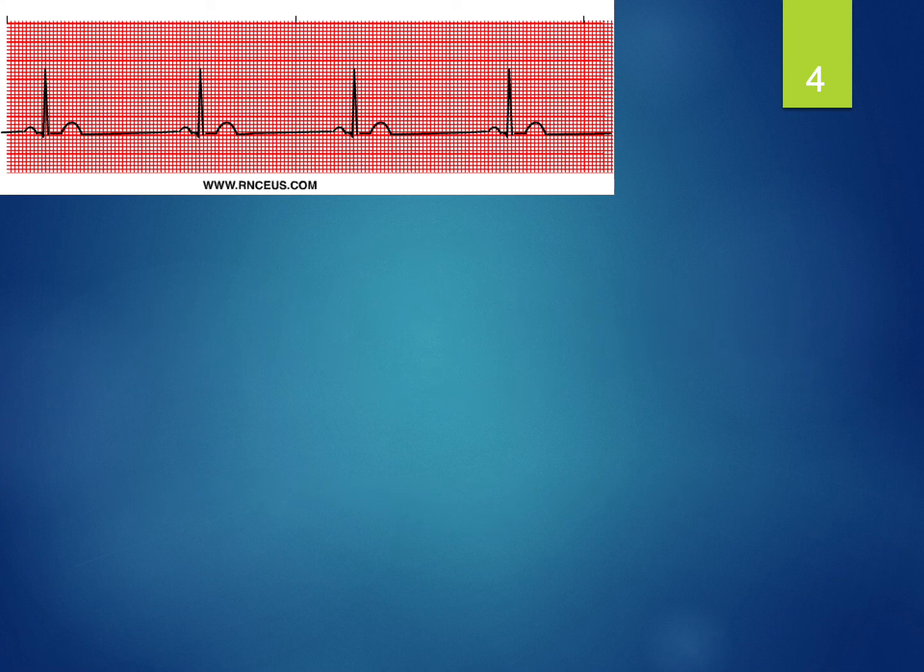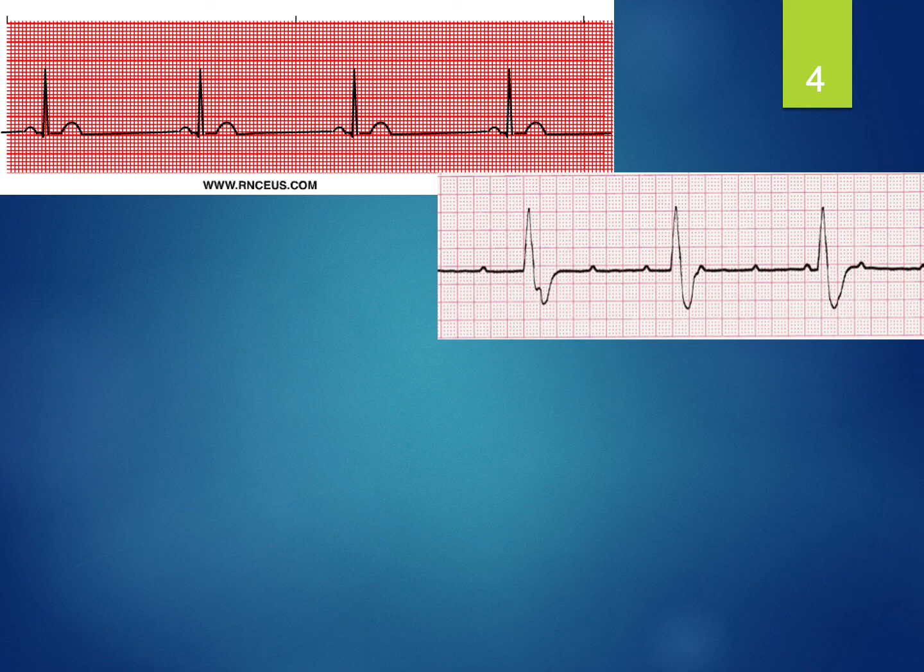So, symptomatic bradycardia. What EKG rhythms might this include? Well, remember, anything slow. So obviously this could include sinus bradycardia, but what other rhythms result in a slow heart rate? Well, think about it this way. Anytime you look at an EKG and you don't see enough R waves, that would be a bradycardia. So what about third degree AV block? I only see 3 R waves here, so my patient's heart is only beating 30 times a minute.